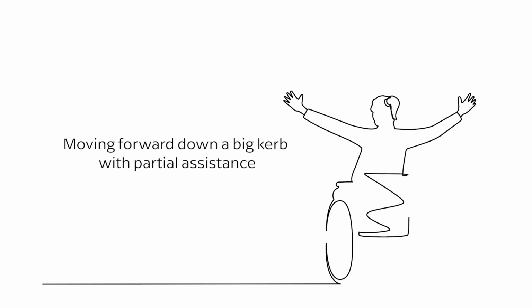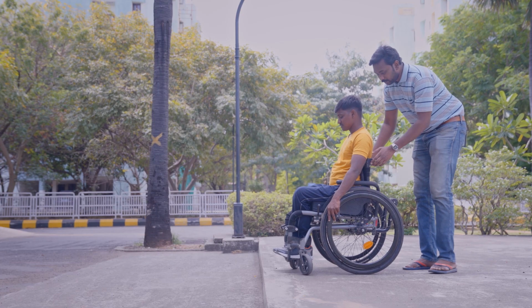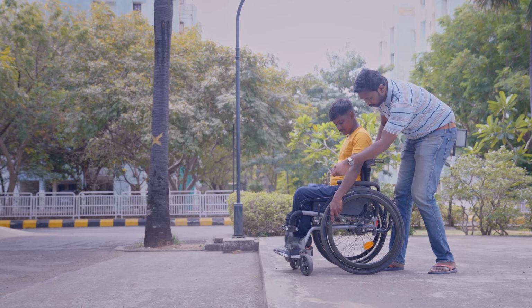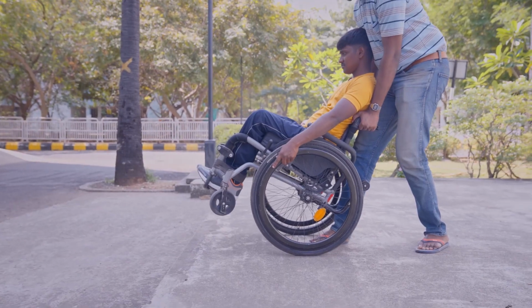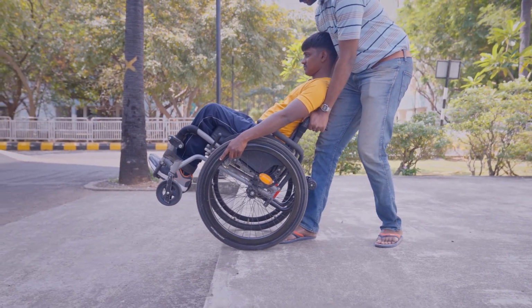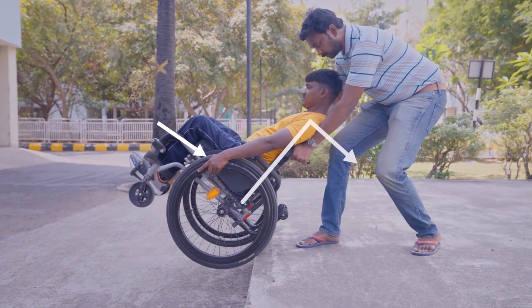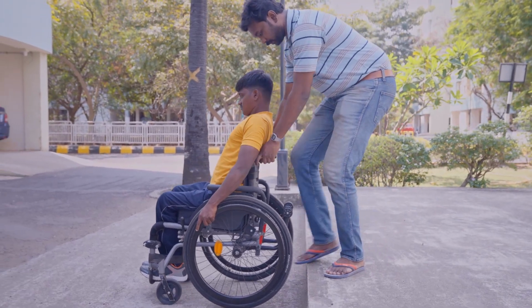Moving forward down a big kerb with partial assistance. To move down a big kerb in forward direction with partial assistance, hold the push rims at the knee level and have an assistant stand behind you. Now, the assistant should pop the casters into a wheelie and move forward. Control your descent with pressure on the push rims as the assistant tilts the wheelchair and lowers the wheels on the ground. Gently drop the casters.